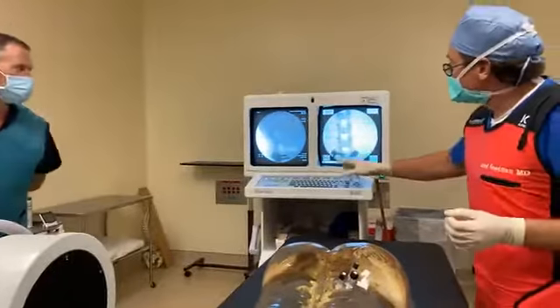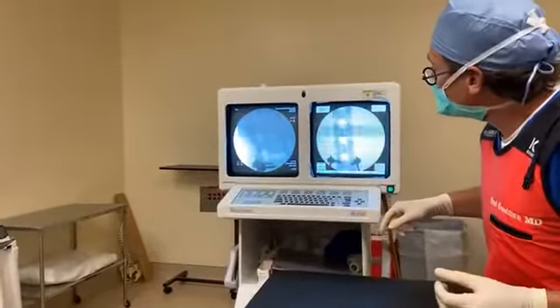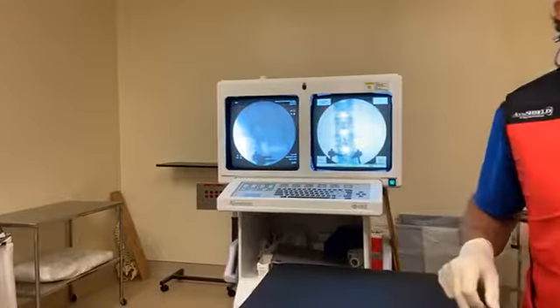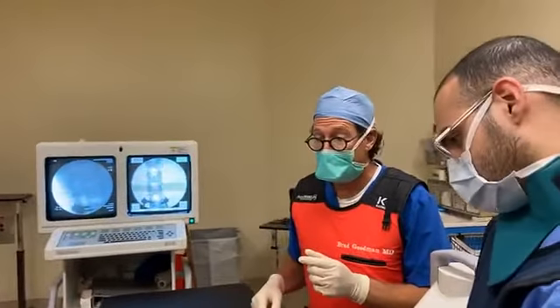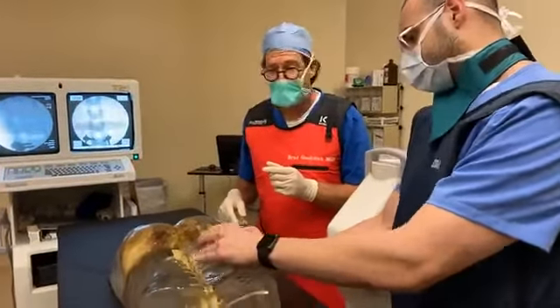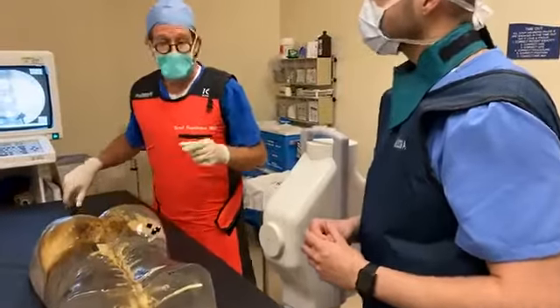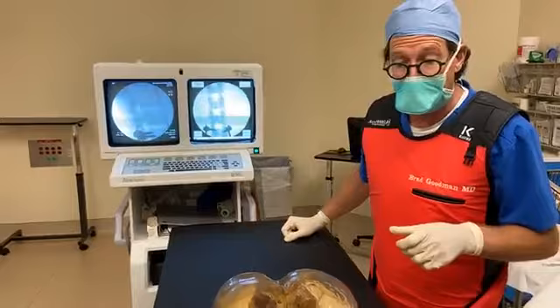So it's not hitting the back of the vertebral body. You see that? So it's probably hitting either the pedicle or the transverse process. So you need to turn the docking notch to the head, traction to the head, see if it'll slide down. Perfect. There you go. And you should see it go in now. Now turn the docking notch back to the feet so we stay under that pedicle.